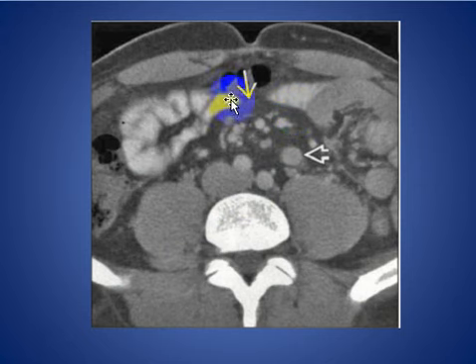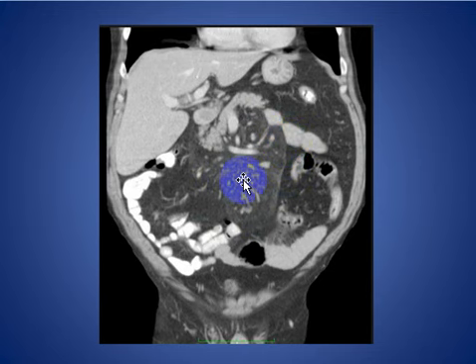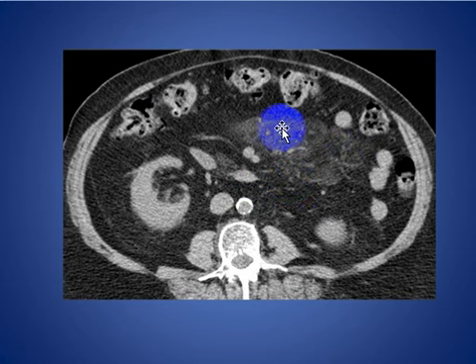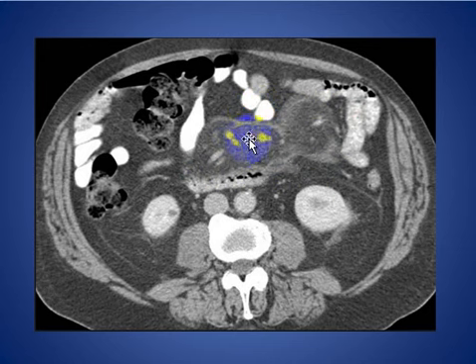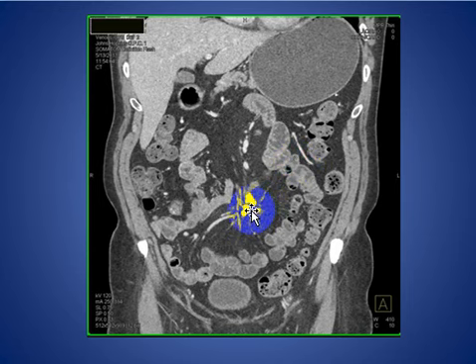Here you see the pseudocapsule surrounding the mesentery with small lymph nodes around the jejunal loops in a patient with sclerosing mesentery. Here is the pseudocapsule and a fatty mass lesion due to sclerosing mesentery with a small mesenteric lymph node. Here is another patient with sclerosing mesentery with a capsule surrounding the panniculitis. Here is an advanced case of sclerosing mesentery with calcification, which can sometimes simulate a carcinoid tumor.